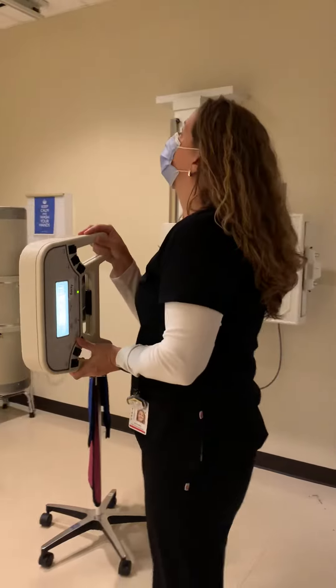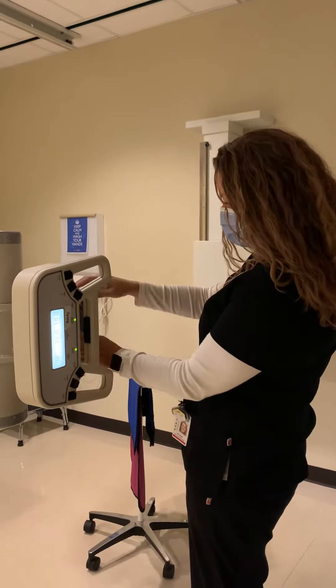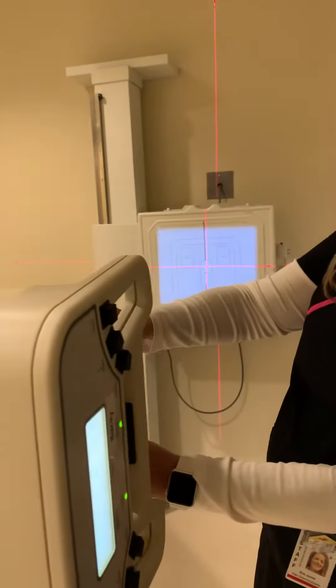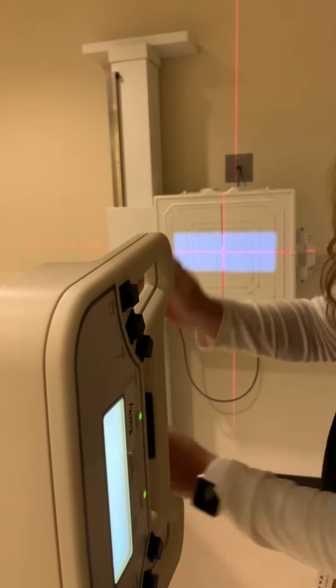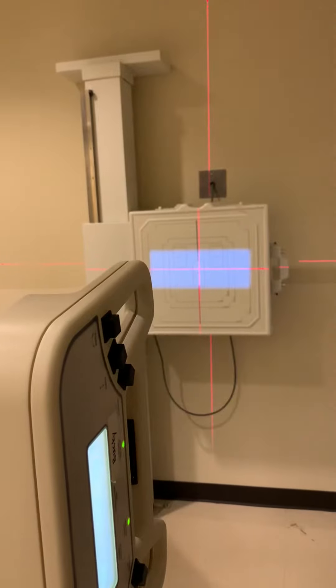We place a 14 by 17 in the Bucky transverse. She's moving the tube to 72 inches SID, and we're going to collimate to 6 by 17 transverse to match the image receptor.